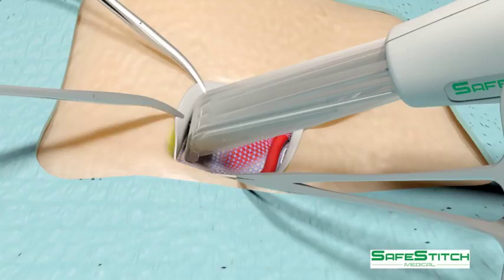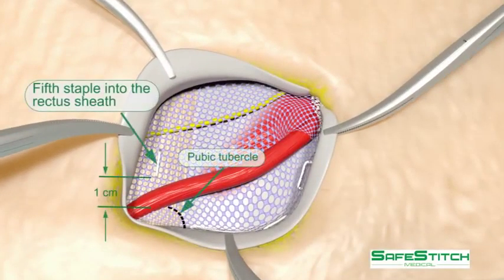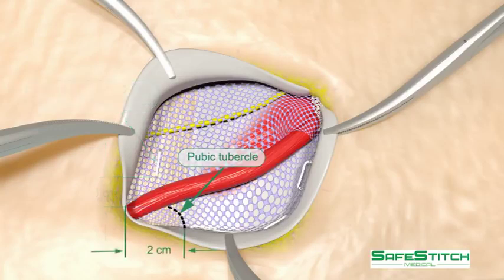The next staple is placed into the rectus sheath, 1 cm cephalad of the pubic tubercle — an important technical detail. The mesh is shown to be 2 cm medial to the pubic tubercle.